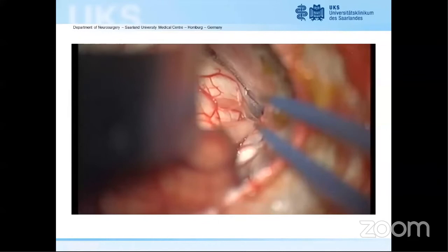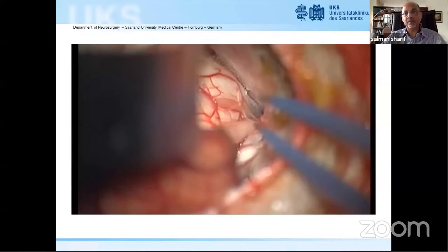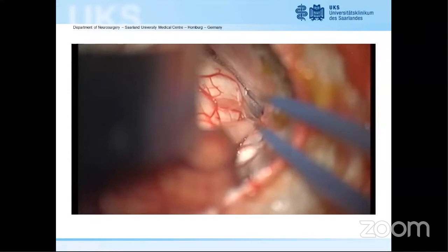Pretemporal, transtentorial, cavernous? Why would you do such a difficult procedure? In the neurosurgical journal, the author maybe is a guy from China. He published this approach for cavernous malformation in the pons.